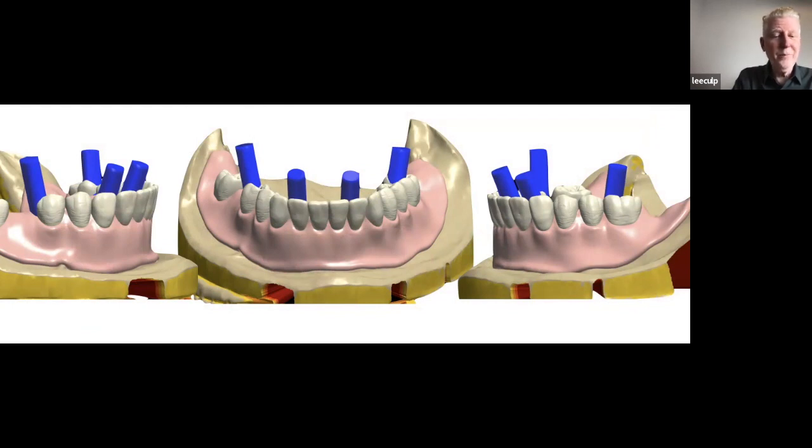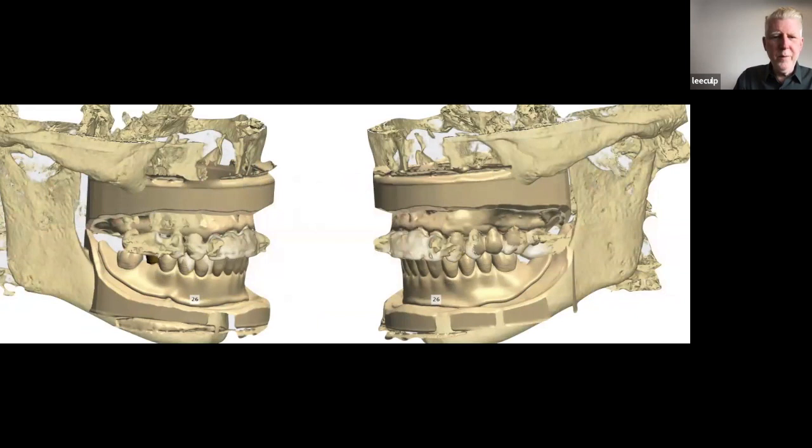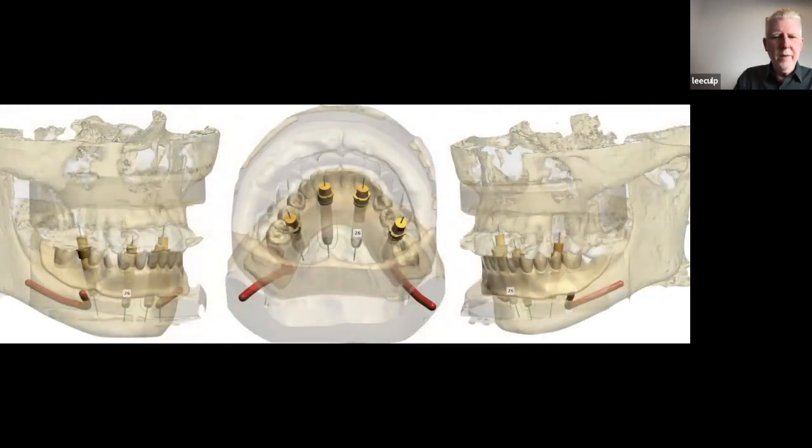I'm like, okay, I'll see if I can make the implant holes come out here. So again, placing everything, tying everything, CTs and dentures back together into the files. And then placing the implants to match kind of where he wanted them to come out. I was able to get it close. It wasn't perfect, because the nerve was in the way on one of them, but actually we got really, really close.